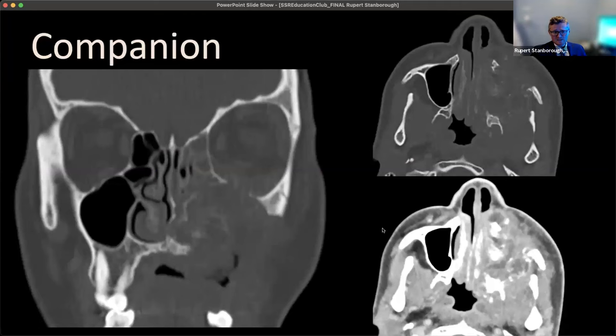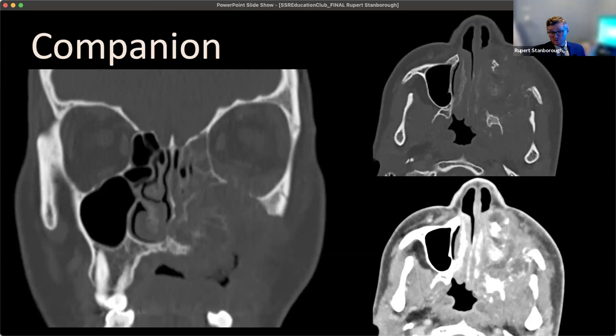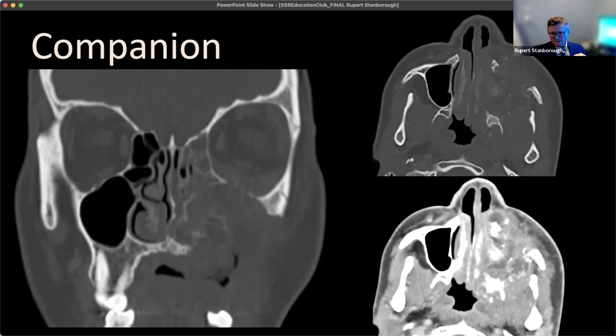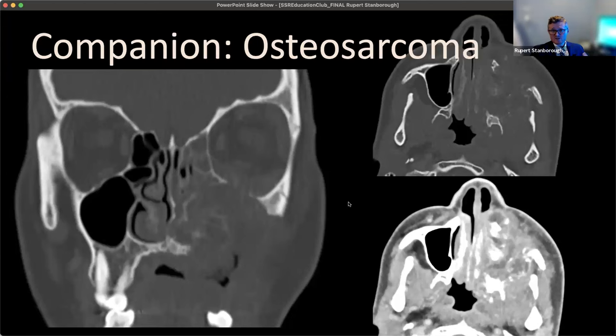Companion case — this patient's maxillary sinus is completely filled with something. We're missing hard palate bone, maxilla, sinus wall, and there's orbital involvement into the nasal cavity. We have bone destruction, a soft tissue mass component, possible necrosis on post-contrast, and osteoid matrix. This also was an osteosarcoma. Wherever bone is, you could have osteosarcoma — it happened to be here in the sinonasal region.